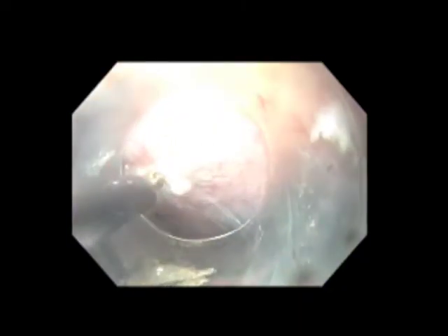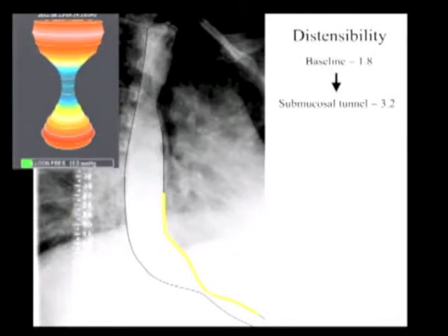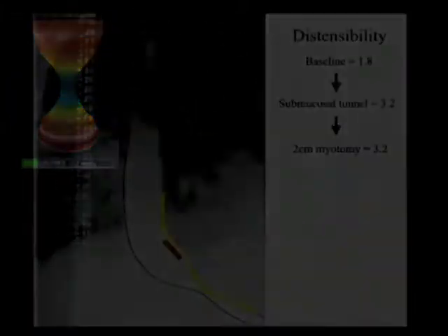We then proceed with the myotomy. In order to investigate the physiologic effect of variable myotomy length, we perform the proximal portion of the myotomy starting at six centimeters proximal to the EGJ in two centimeter segments and take FLIP measurements after each segment. The triangle-tip cautery knife is used to individually hook and cauterize individual muscle fibers. After the myotomy has progressed two centimeters, we check another FLIP measurement. The myotomy, indicated by the red line, shows that the first two centimeters has not resulted in any change in EGJ distensibility.